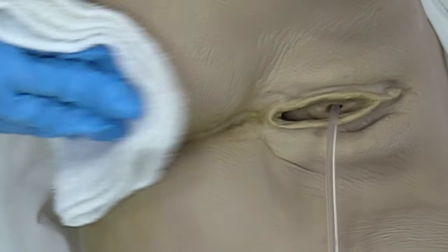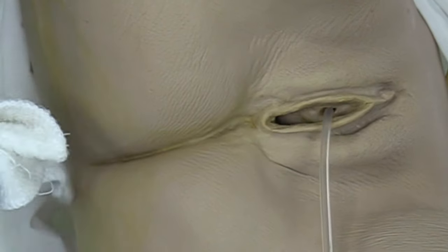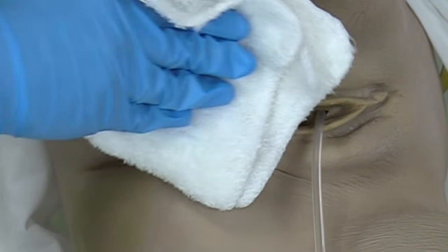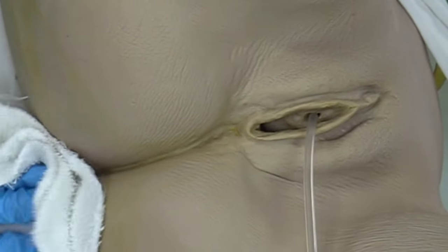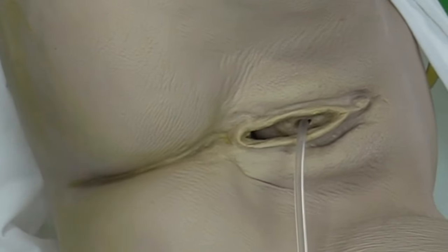Front to back, front to back, discard and get a dry one. We have our dry cloth, and again, we're gonna go in the same sequence and pat it dry. So front to back, patting dry, front to back, patting dry. And then our last leaf, and discard this.